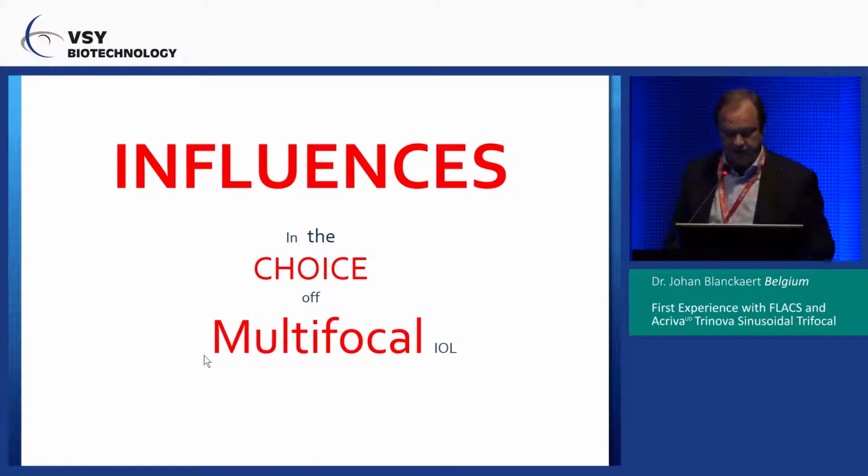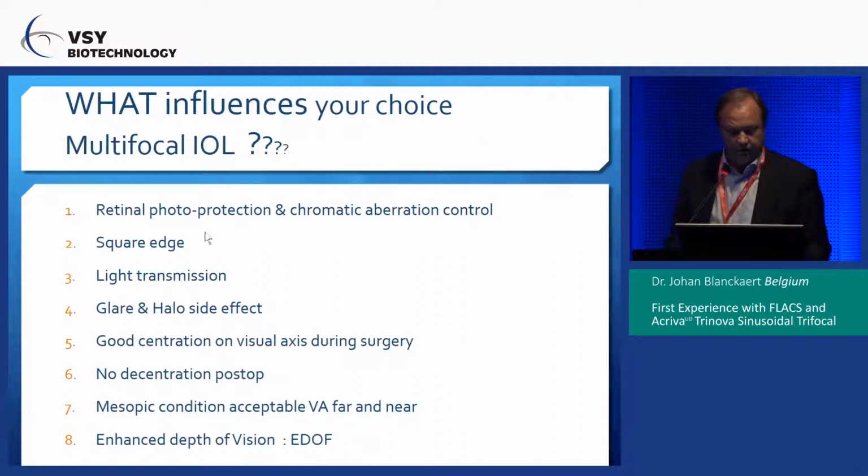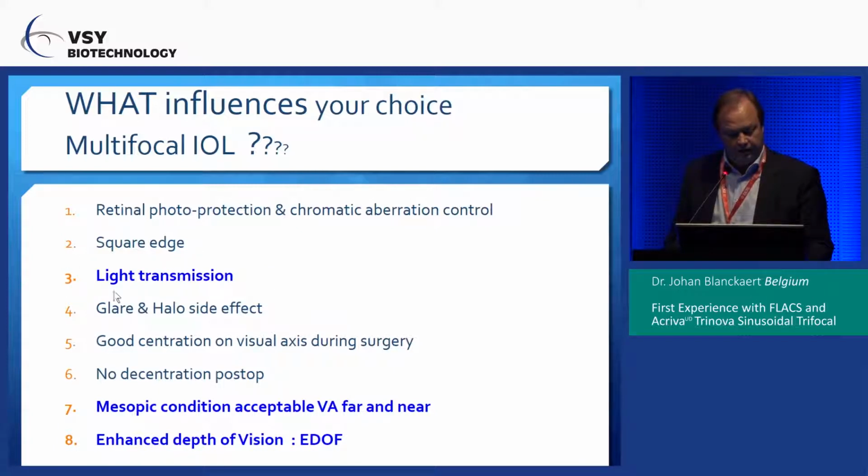My choice in choosing a multifocal IOL: we have a lot of criteria. We have the obvious ones: chromatic aberration control, retinal photoprotection, the square edge for the PCO. But really, I like the fact of light transmission and the mesopic conditions, acceptable vision in far and near focus. That's the key point which is important for my patients.